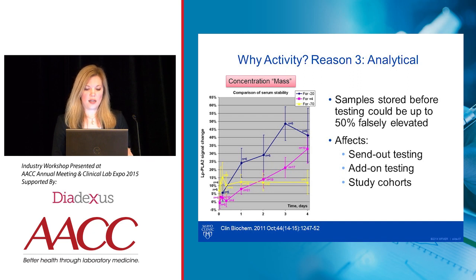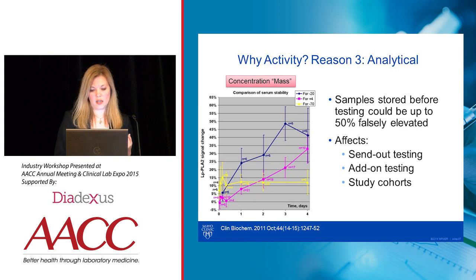The blue data is samples stored frozen at -20 for up to 4 days, and then the yellow data are samples stored at -70 for up to 4 days. So what you can see is that if samples aren't tested until 3 or 4 days post collection, the concentration can be elevated.